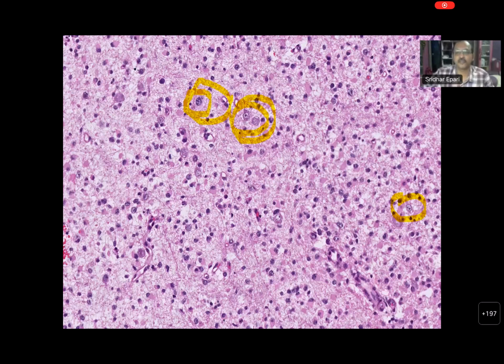You must have seen the slides earlier also, right? Yes, you can look for it. It's not that evident, so you can't see a mitosis here. Is it important for a mitosis to be seen? Why is the mitosis important? For the grading, yes. What is the grade difference? If you find mitosis, where do you go? If you don't find mitosis, where do you go? Significant mitosis, grade 3. A few mitosis, it is grade 2.